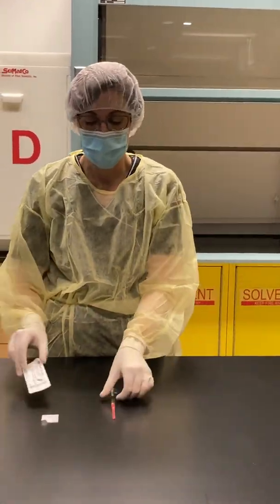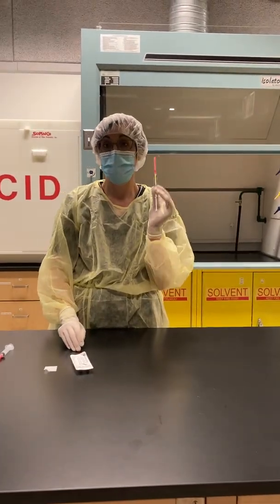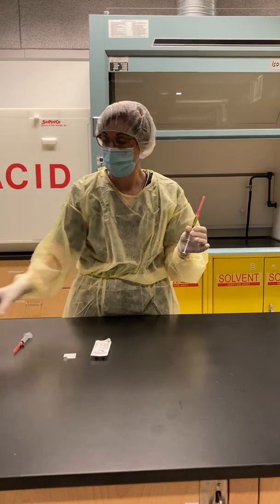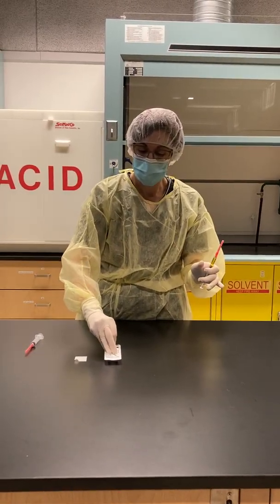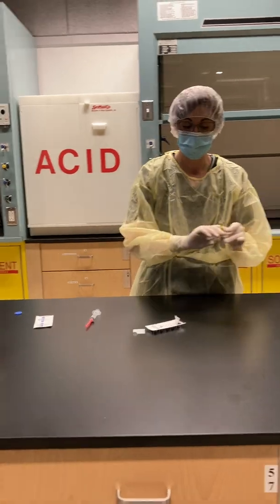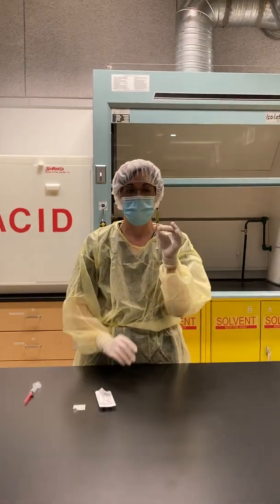If the patient is receiving the medication as an IV push, we never dispense a medication to the nursing floor with the needle still attached — we would put a tip cap on it. Pull the tip cap back, remove the needle, and always discard it in the sharps container. Then push the tip cap down, and now it's ready to go.